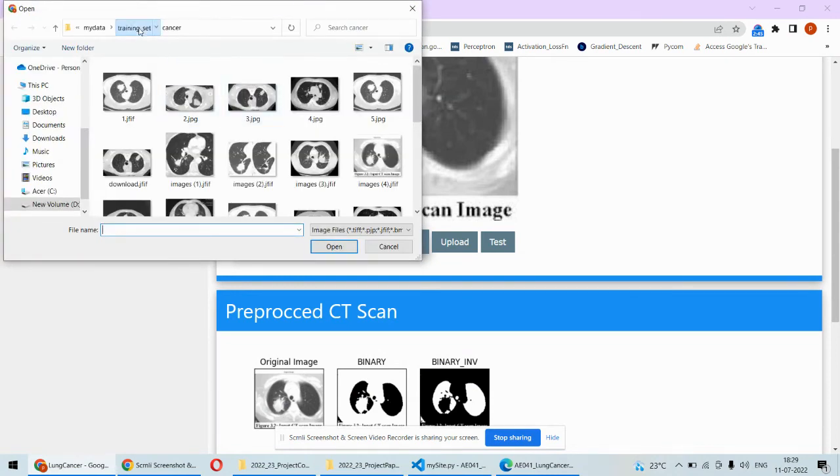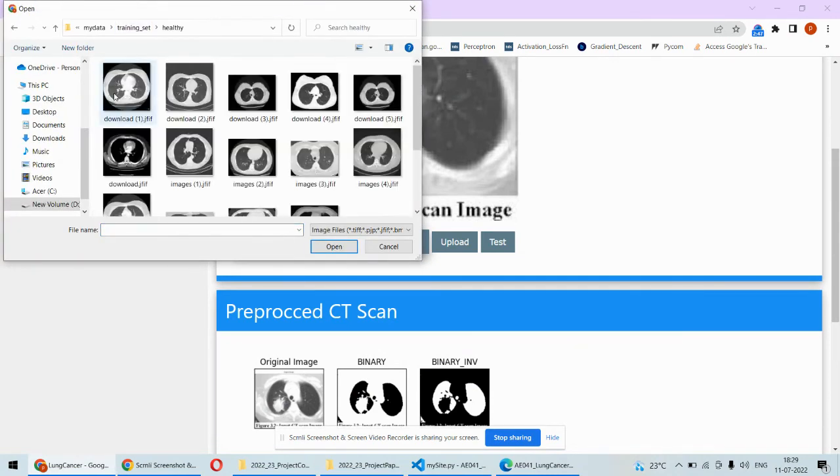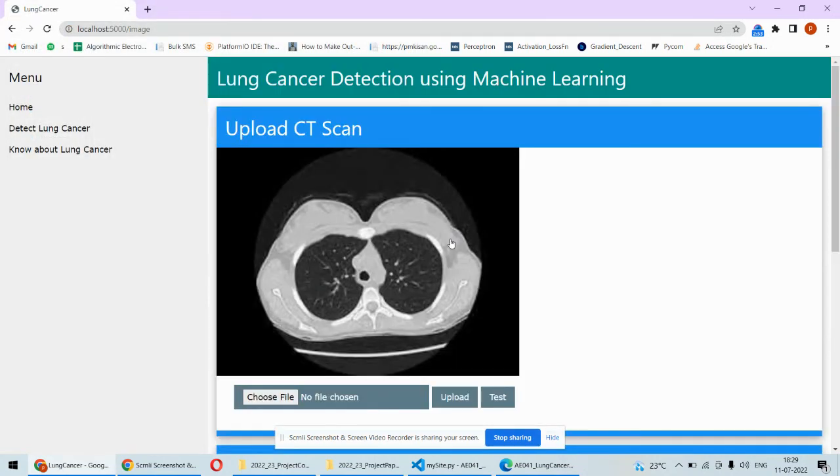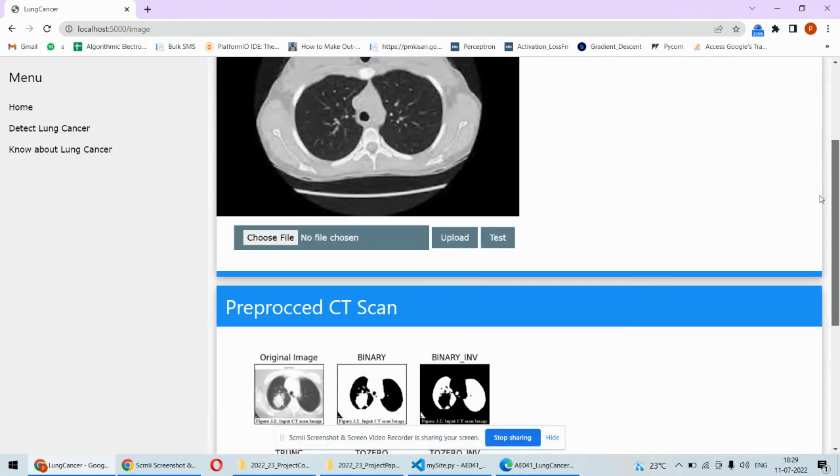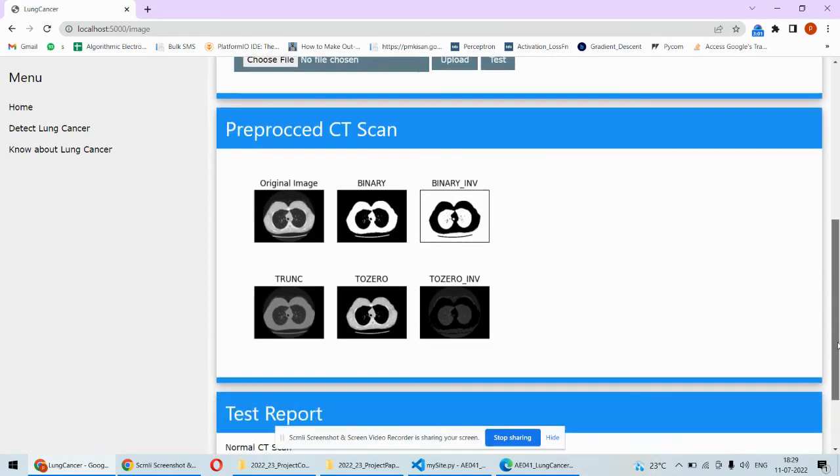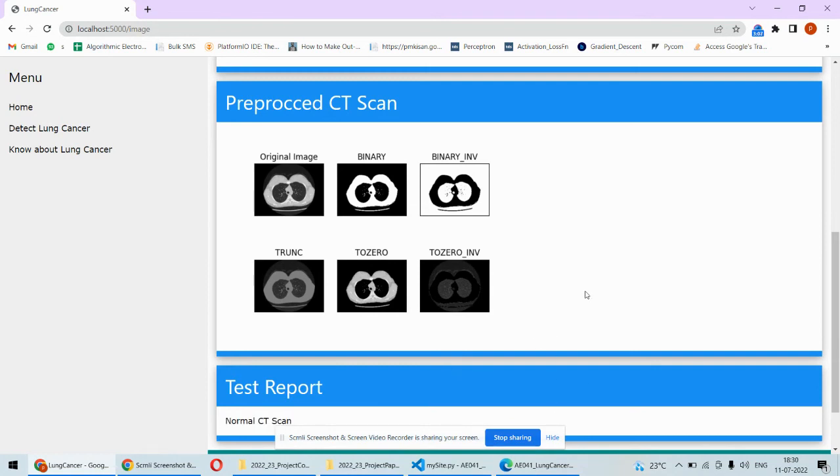But if I pick something different, let's say we now pick up the healthy image which is not having any kind of cancer, for example this one, and then we open it and upload. Right now this is the previous result, so once I click on result we'll get the fresh results. This time we are getting the fresh result and we are getting over here normal CT scan.